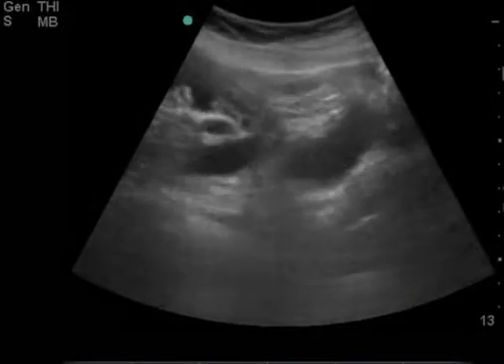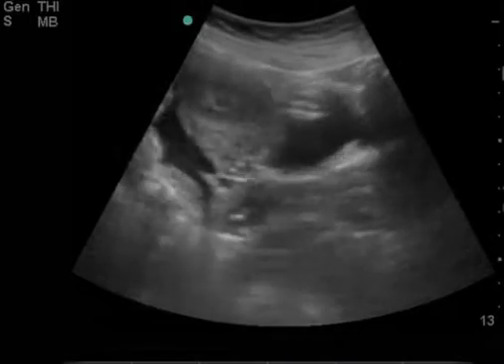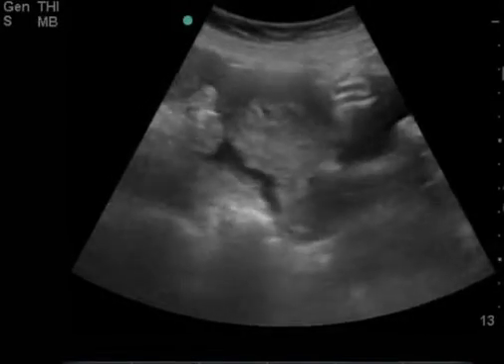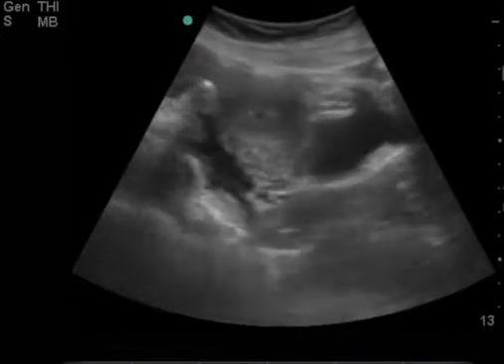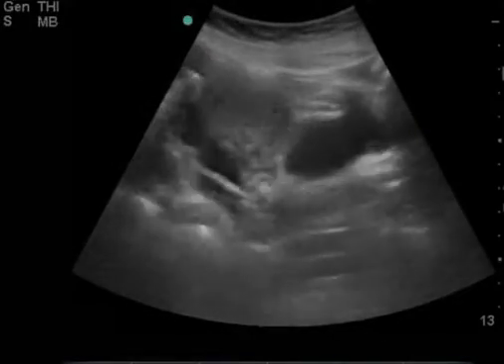This is a 30-ish-year-old female who came into the ER with sudden onset left side abdominal pain. She was found to be tachycardic, and she also reported having vaginal bleeding that was new. The ER provider, given how much pain she was in and how tender she was, brought the ultrasound to the bedside and right away found the diagnosis without any pregnancy test back or any lab back.